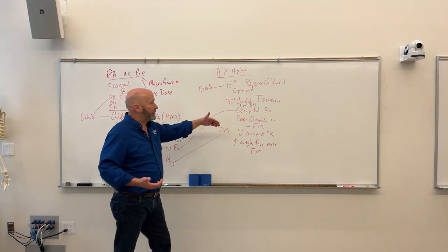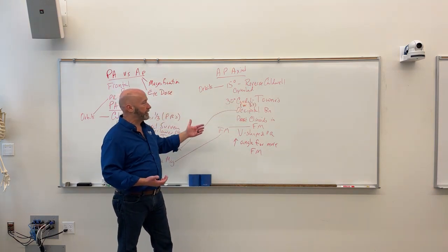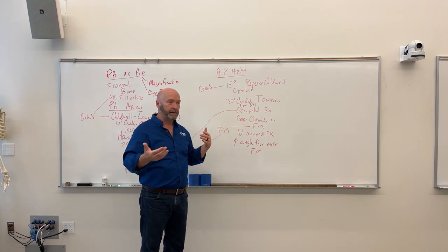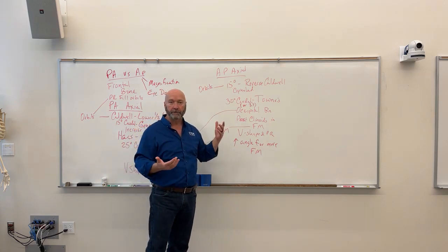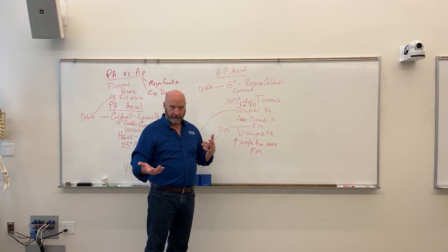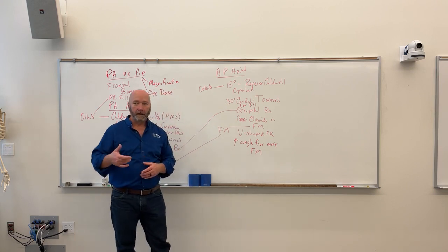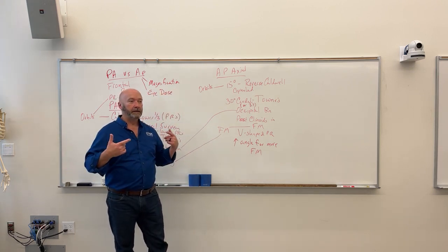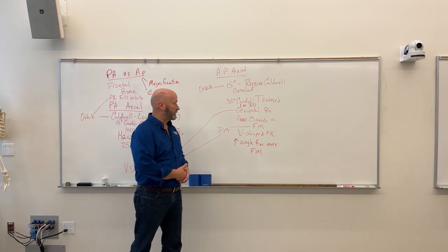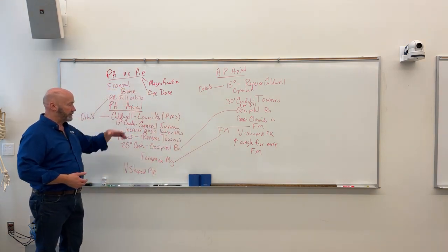So that's the thing that we're going to do throughout the semester: what if the patient can't get their orbital meatal line perpendicular or parallel to the image receptor, then we're gonna do what? If the patient can't accomplish something, positioning wise, what do we do? We compensate with angulation of the central ray, right? So then again, the things that you're going to look for is Towns and Haas.